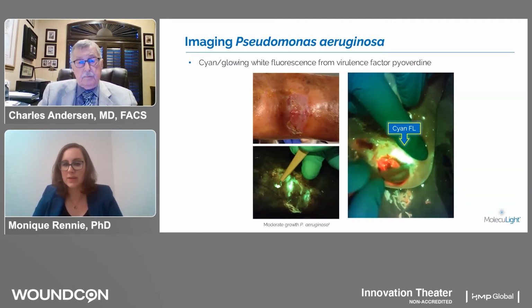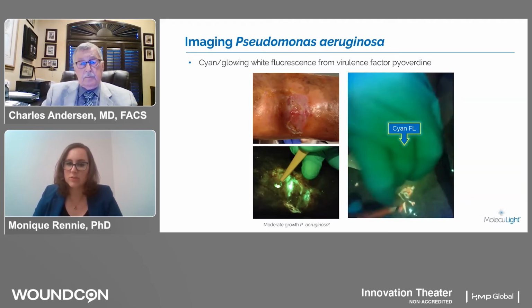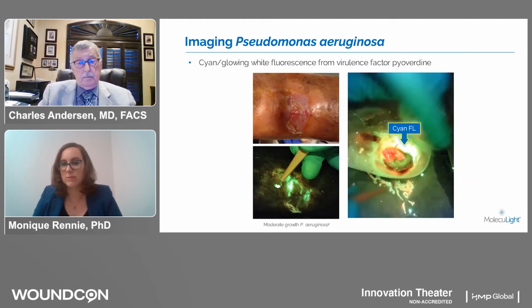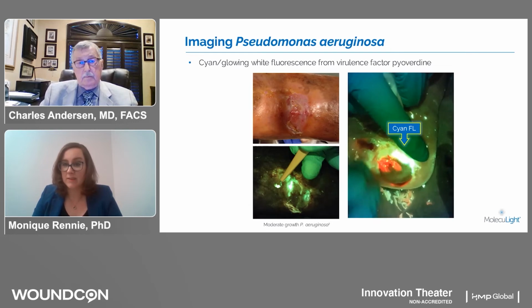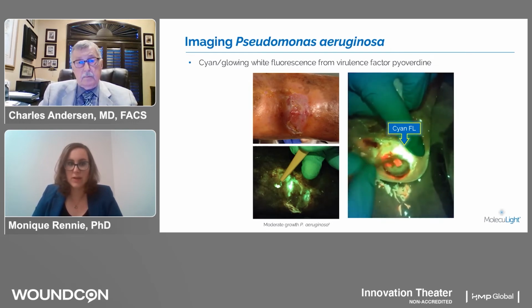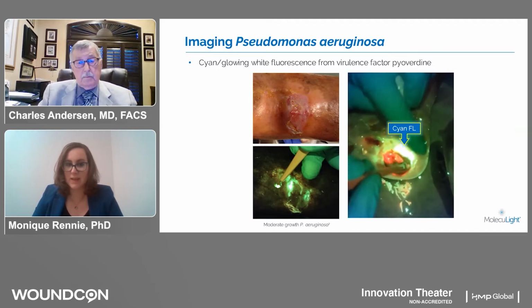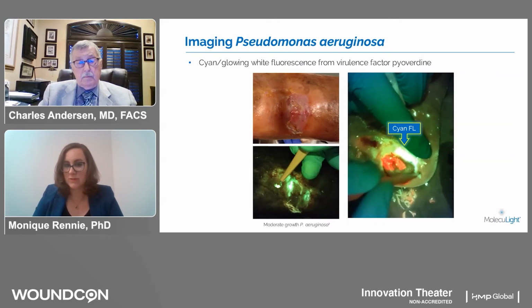So you can see here an image of debridement on the right, and that hot white that you see, this is all Pseudomonas around the wound. And this is a nice example of doing debridement under fluorescence, so you can immediately see the feedback on what's being removed, and I think just as important of what's remaining in that particular tissue. And then on the left, you can see another example of Pseudomonas where it's actually been picked up on a curette, and you can see it fluorescing. So when clinicians see that particular color, they can know that Pseudomonas is in a wound.